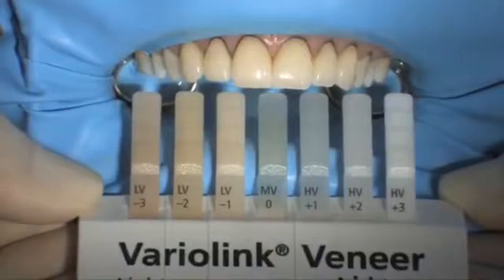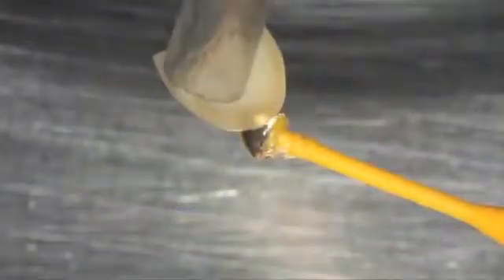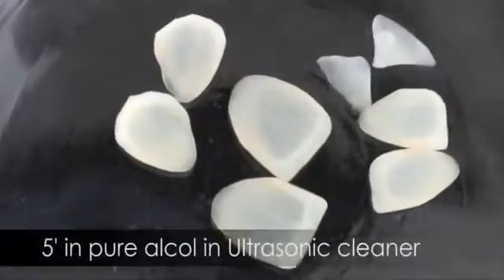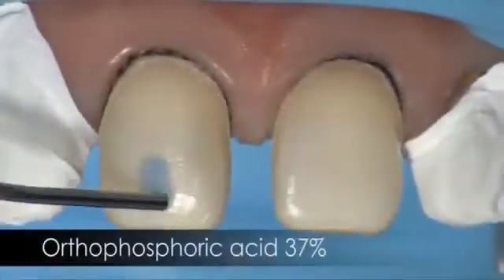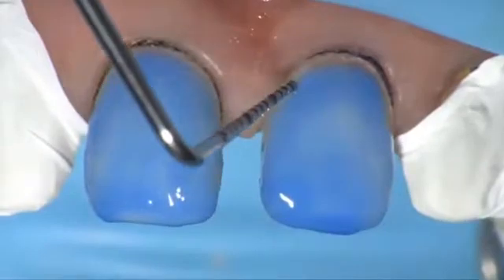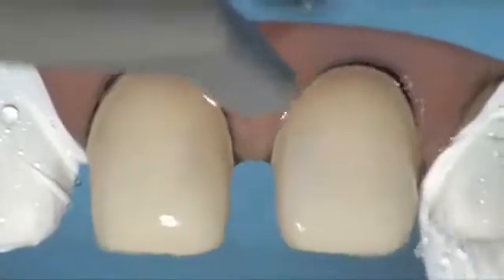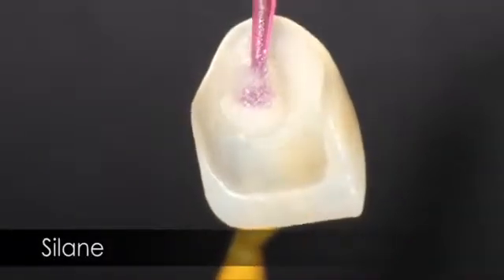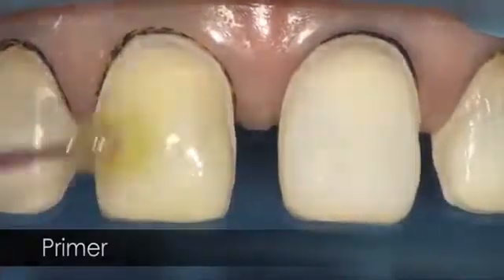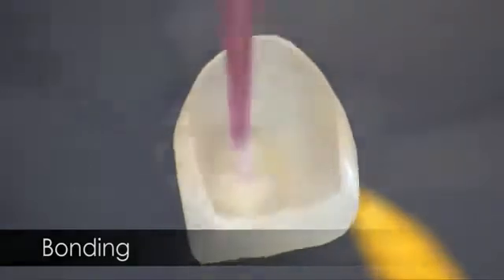After the selection of the right cement shade, all the phases for an optimal adhesive cementation were followed in order to obtain a perfect cementation: etching and cleaning of the veneers, etching the teeth with orthophosphoric acid, then silanization of the veneers, primer and bonding on the teeth, and bonding on the veneers.